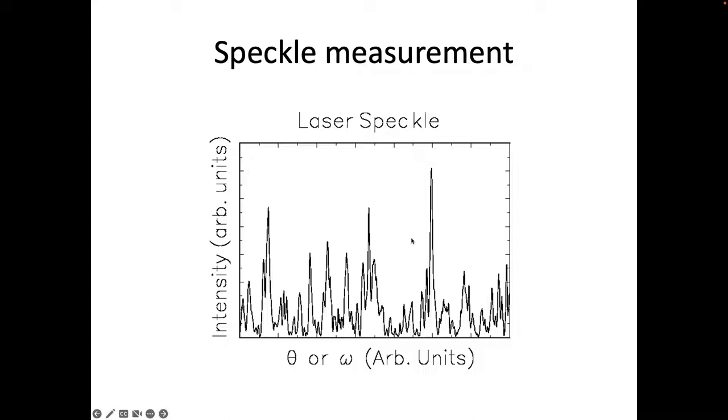Okay, another way of looking at this problem is complicated calculation, but I often can say my intensity I can determine from the sum of the fields in a complex plane, because E1 is a complex number, E2 is a complex number, and so on. So I can draw a complex plane and say, okay, this is my vector E1. It has a certain amplitude, that's the length, and it has a certain phase given by the angle. And now I get my second field, my field E2, and I can just put it on top of it. This is my field E2. And my field E3. So I make it a vector sum. And this kind of just becomes Brownian motion sort of thing.